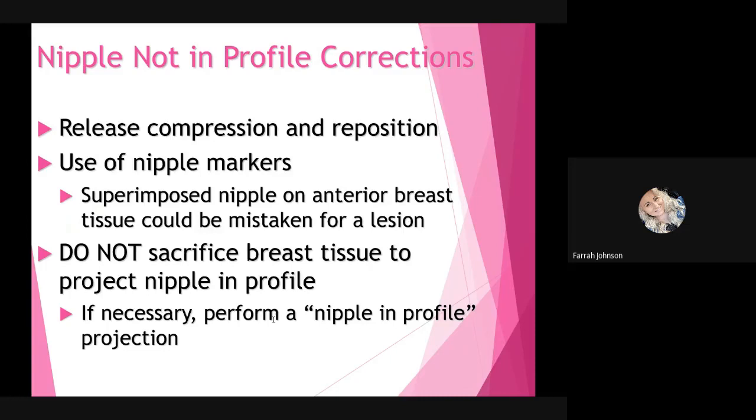You want to make sure that you do not sacrifice breast tissue to project the nipple in profile, as the nipple in profile only has to be on one projection. So if you're going to end up clipping tissue by getting it in profile, do not sacrifice that breast tissue. Go ahead and just make sure it's in profile on your other projection.